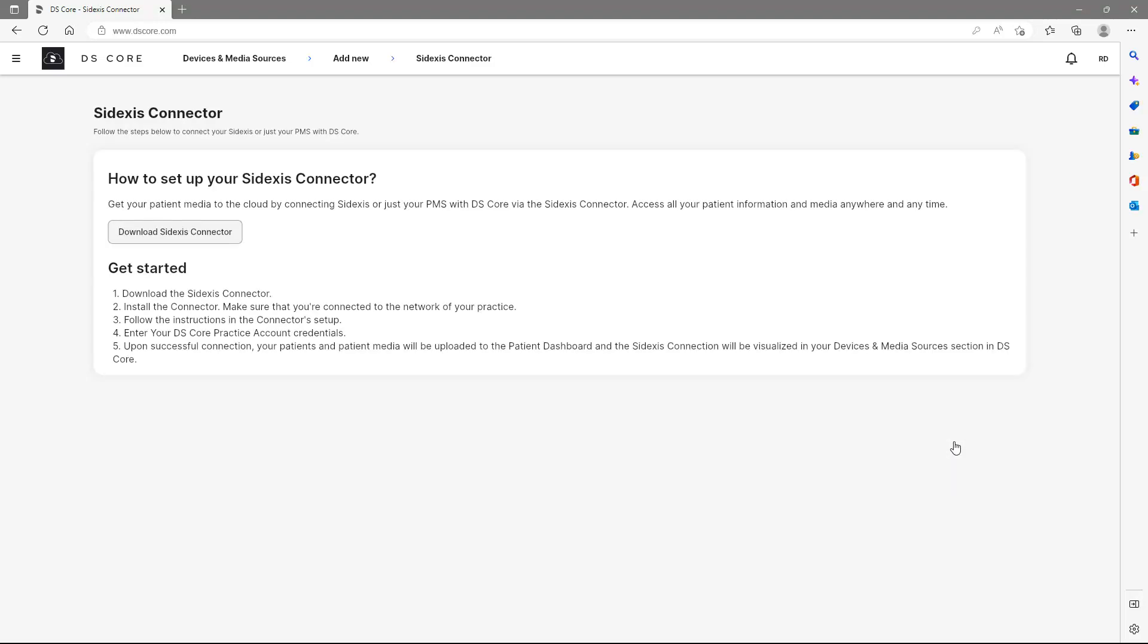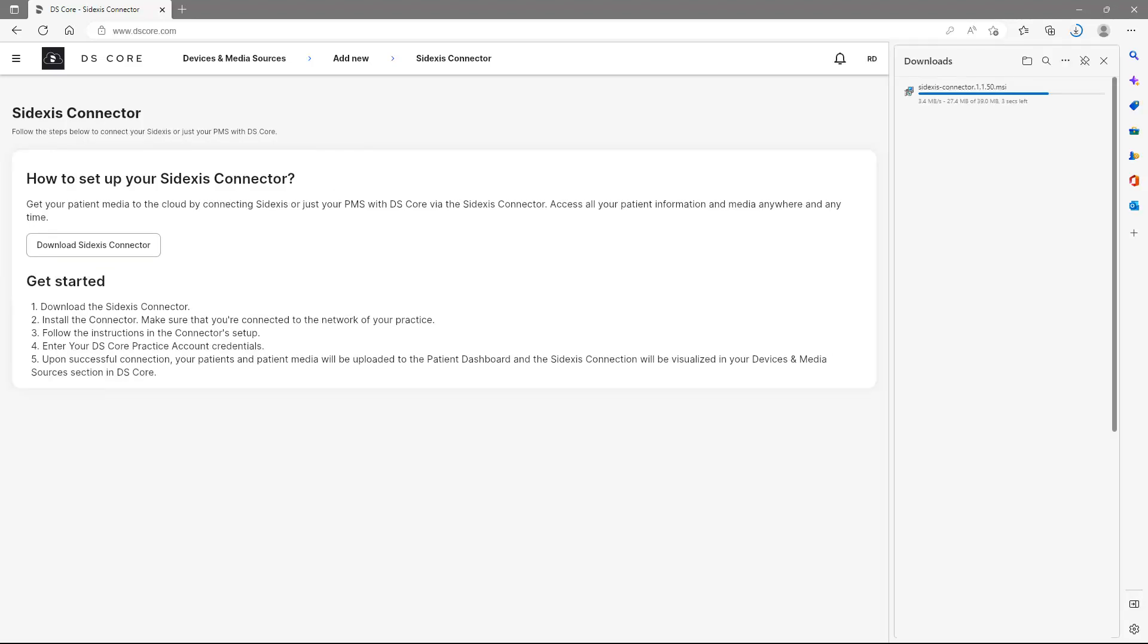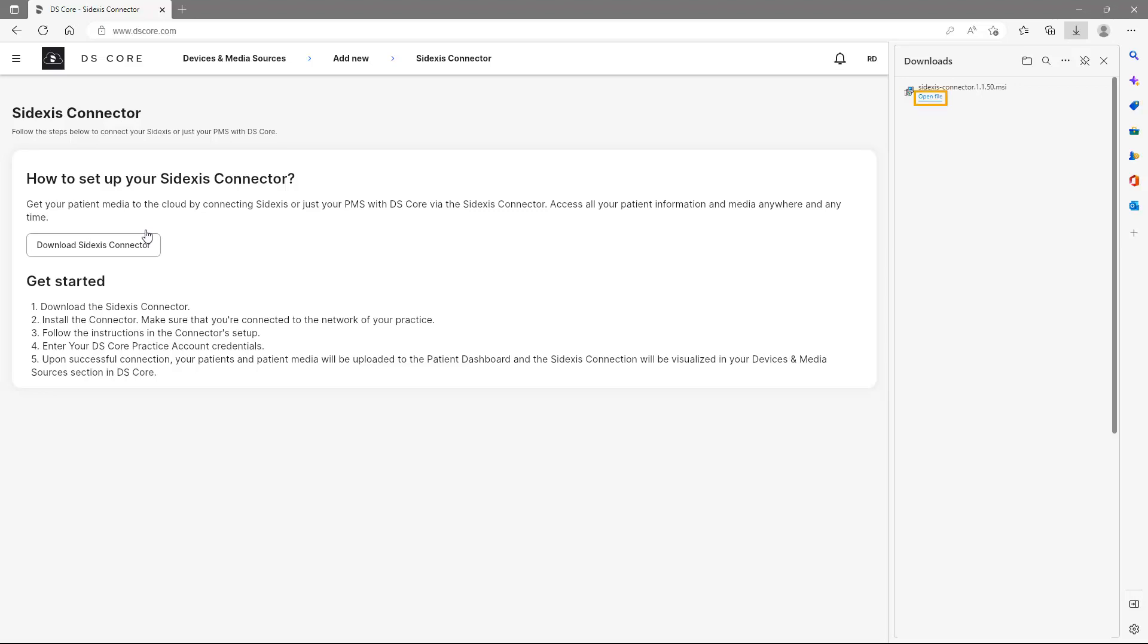Next, we download the Sidexis connector. The download status is shown on the top right. This can be different depending on your web browser. As soon as the Sidexis connector download is completed, we tap on Open File. Please make sure that you are connected to your practice network at this stage.